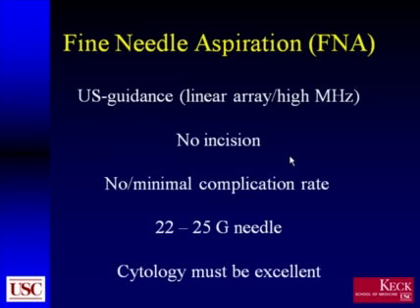We think that fine needle aspiration biopsy is an excellent technique in the evaluation of salivary and perisalivary lesions, again, done under ultrasound guidance with no incision necessary. We've found no or minimal complication rate, and typically we use a 22 to 25 gauge needle.